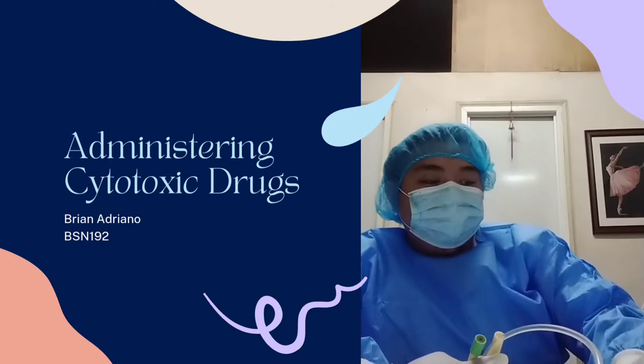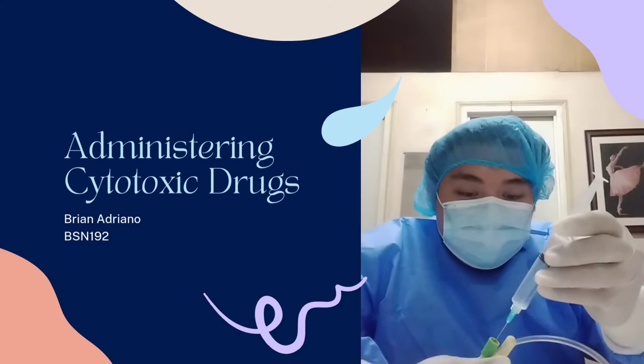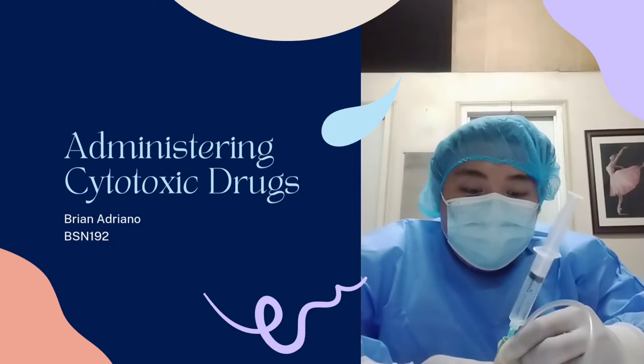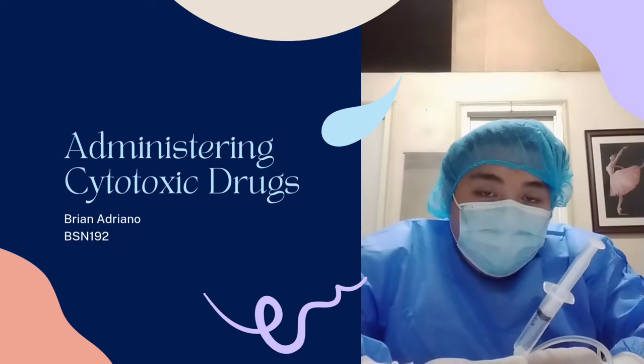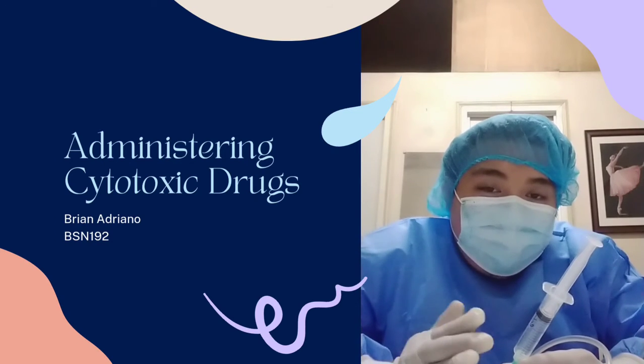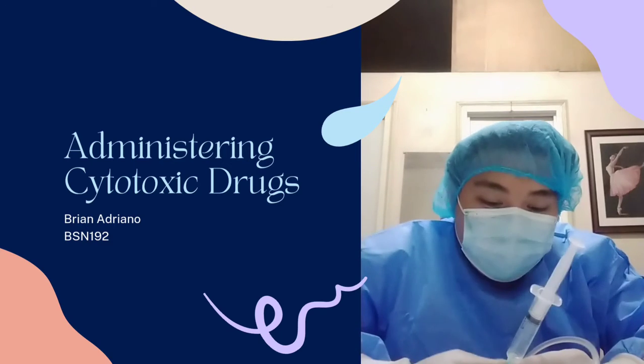And after this, insert and slow IV. Take note that this drug is the physician's order, and we have the exact amount that is needed to be given to the patient.